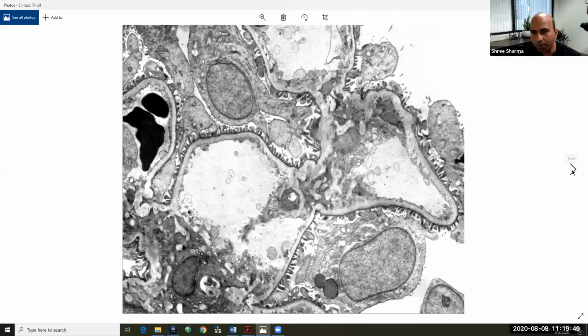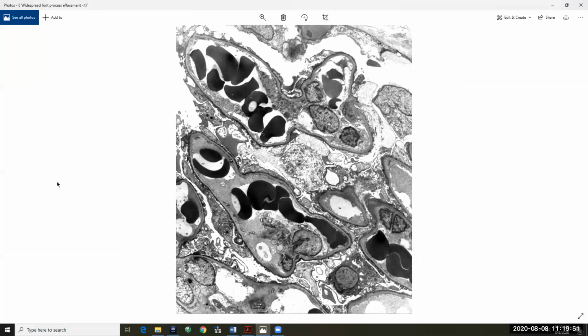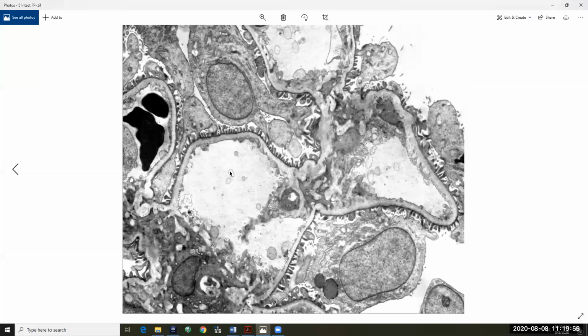They look like those sea anemones with the little fingers. It does. Like I need to see Nemo in there. Jumping around, yeah.